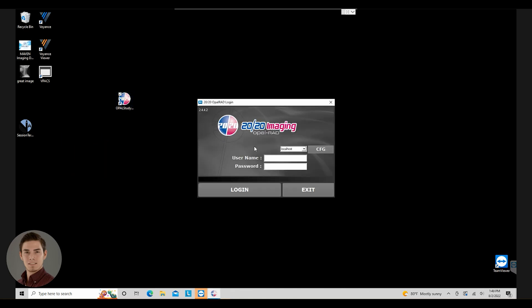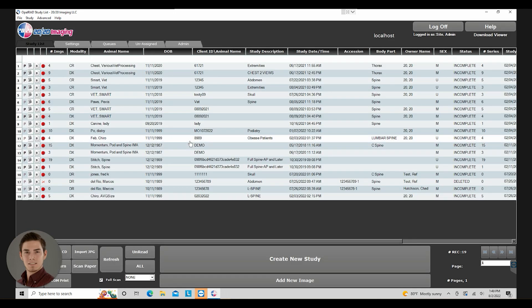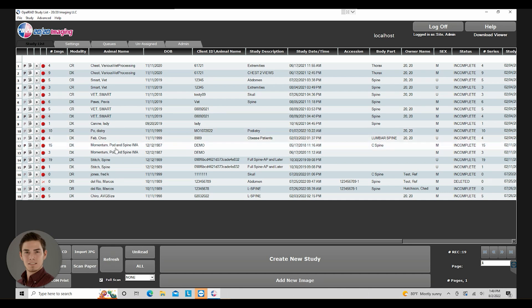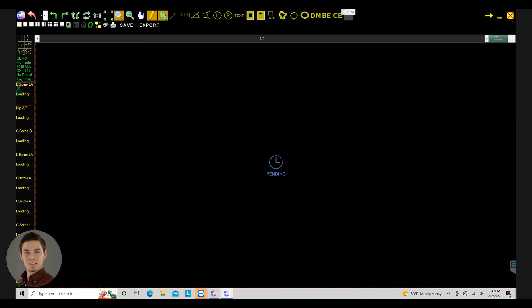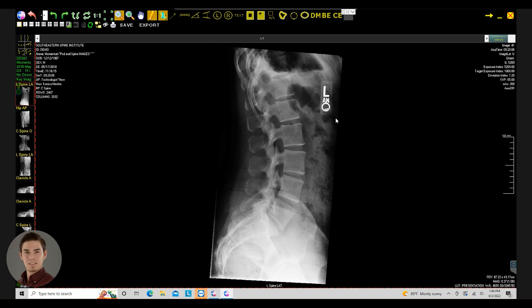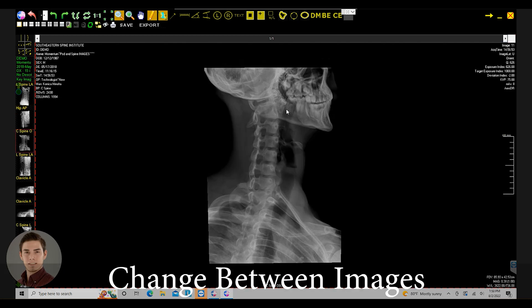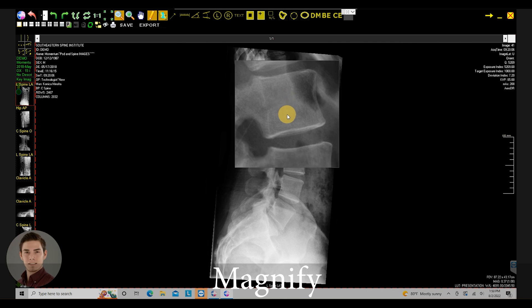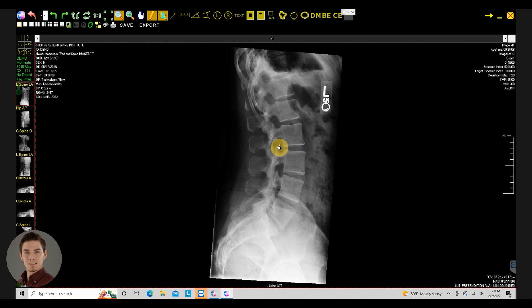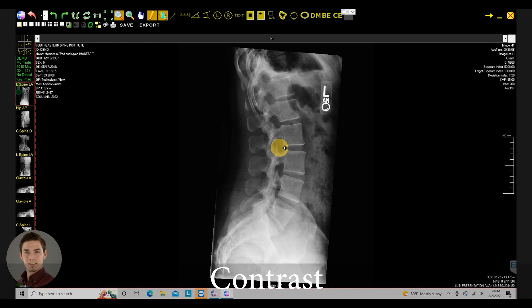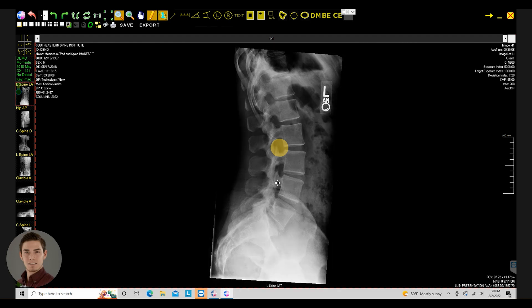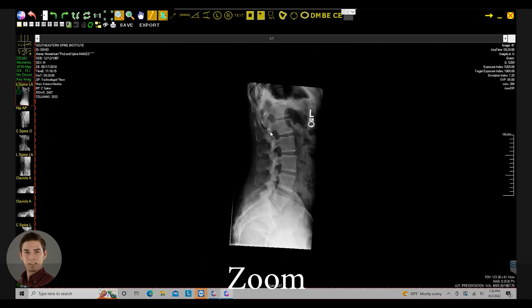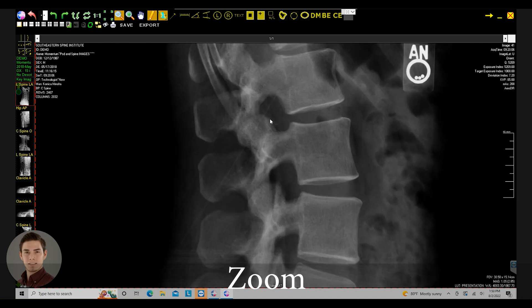We're going to start by opening the software. This brings us to our study list, and we're going to select one of our studies here by double clicking. Now we have our study open. With the scroll wheel you can go between different exposures in the study. If you left click and hold it will magnify wherever your cursor is. If you right click and hold you can change the image contrast by going left and right as well as up and down. By clicking and holding the middle scroll wheel and going up and down you can zoom.